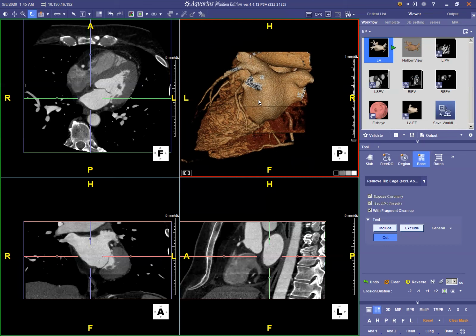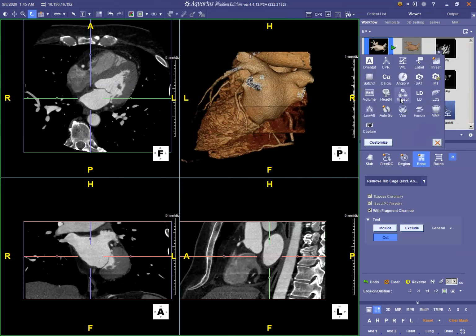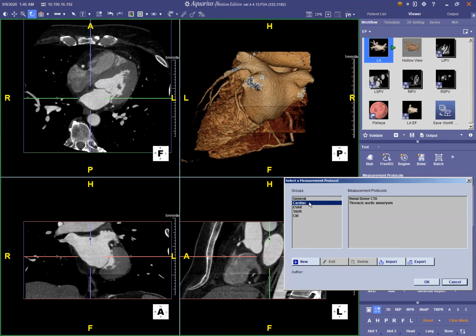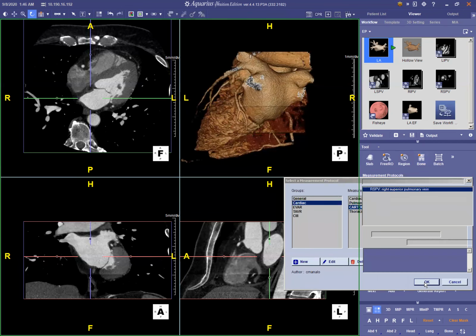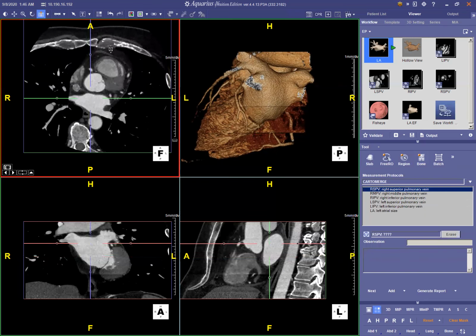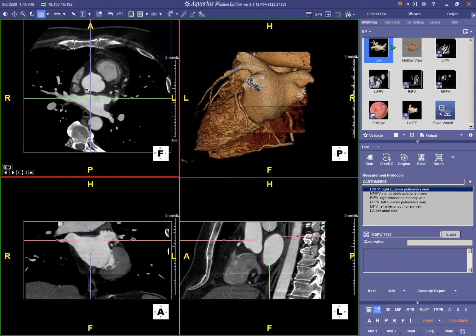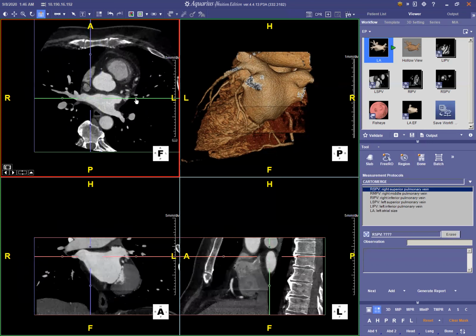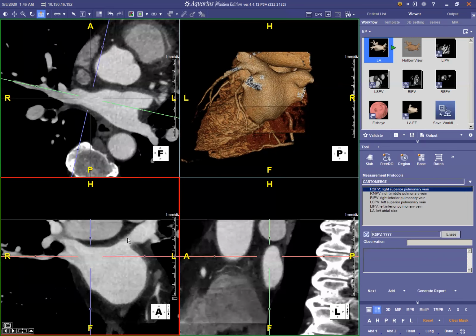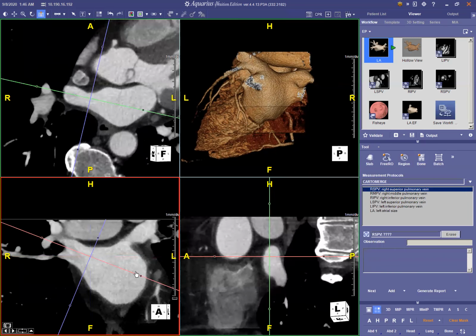So I also have a measurement protocol built in for these Cartomerge studies. Under cardiac, I believe, called Cartomerge. And now it's time to measure the veins. So we'll go to the right superior pulmonary vein and make sure again we're orthogonal to the long axis of the vessel.